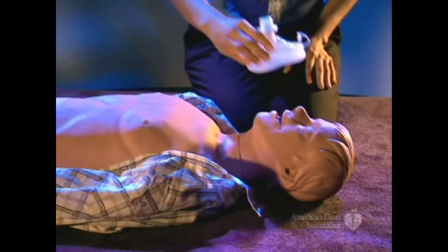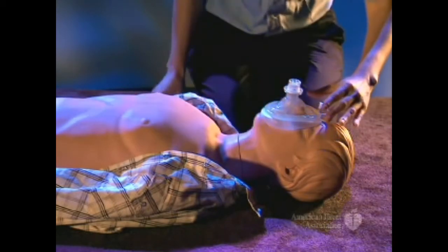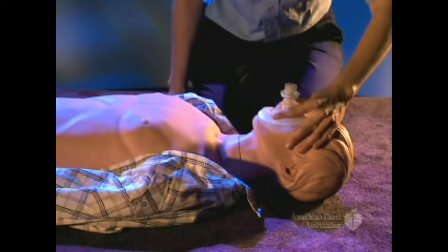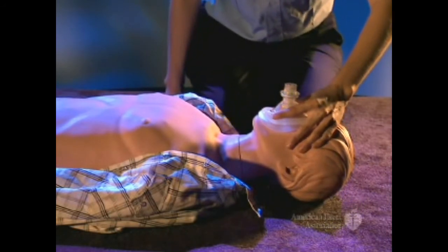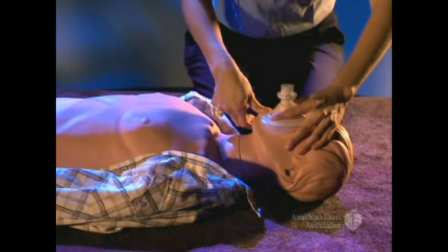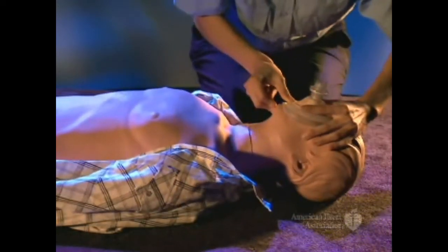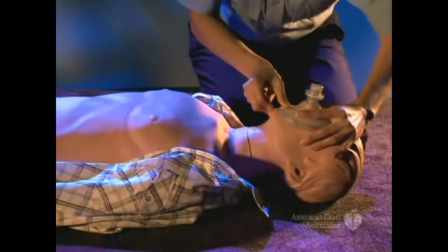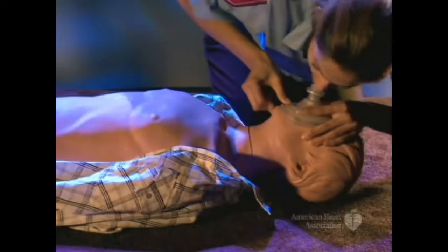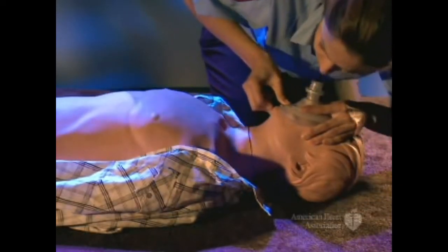Kneeling next to the victim, place the mask on the victim's face, using the bridge of the nose as a guide for correct position. Seal the mask by placing the index finger and thumb of your hand closest to the top of the victim's head along the border of the mask. Place the thumb of your other hand along the lower margin of the mask. Open the airway using a head tilt chin lift. Press the mask down and lift the jaw to hold the mask tightly against the face, and give 2 breaths while watching for chest rise. Each breath should be delivered over 1 second.